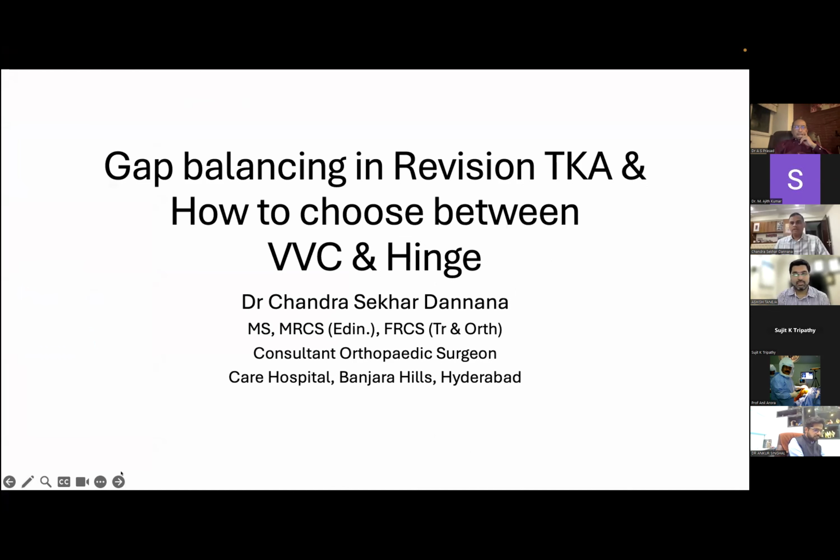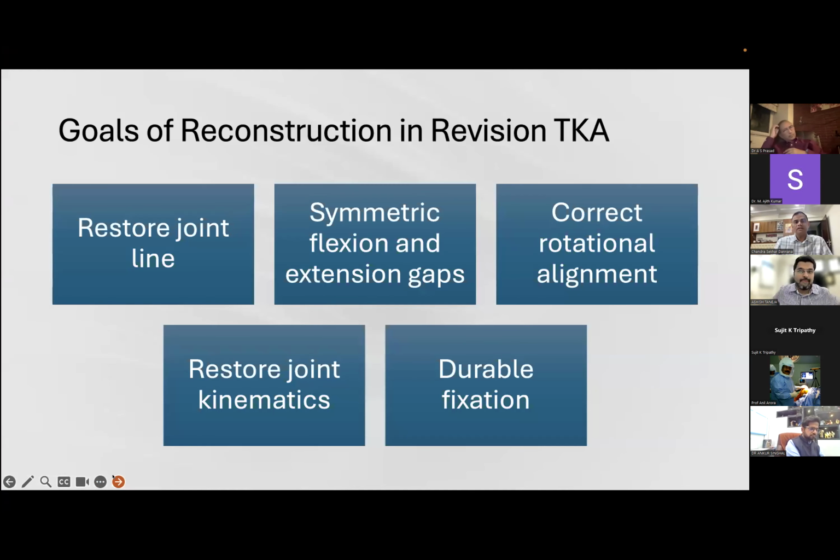Good evening, everyone. Thank you very much, first of all, for having me in this webinar. So the talk is about gap balancing and levels of constraint in revision total knee arthroplasty. The goals of reconstruction have been already explained in the previous talks. They remain the same as for any primary total knee arthroplasty.